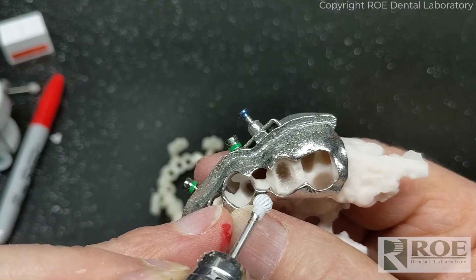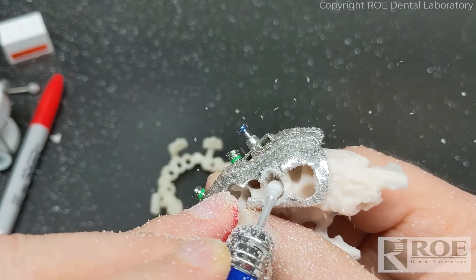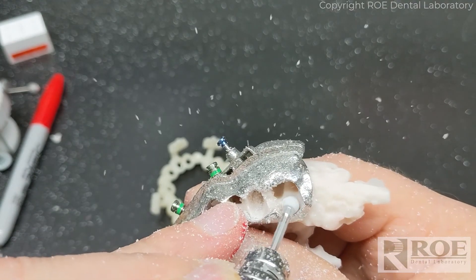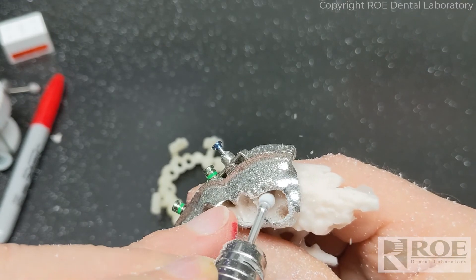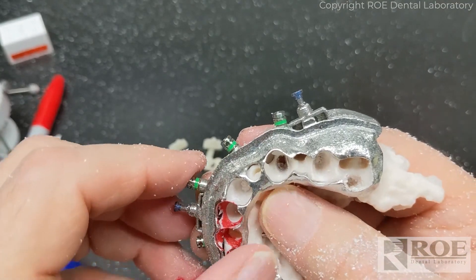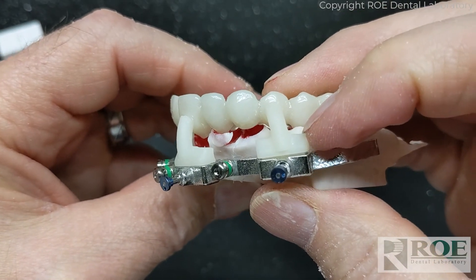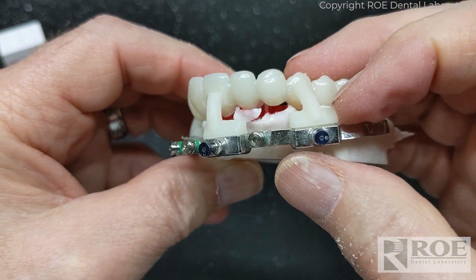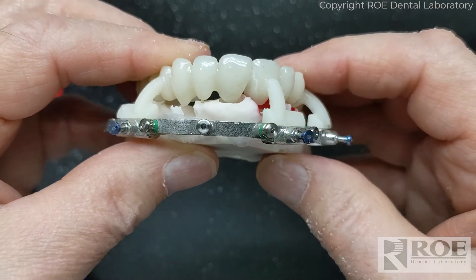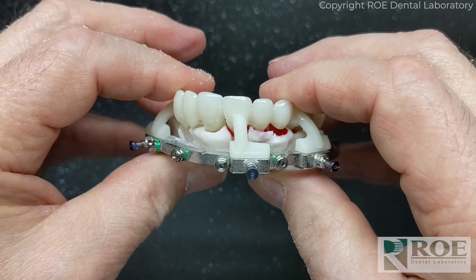The prosthesis now fits. I am however going to use the guide to open up the crest of the bone to the footprint of the prosthetic tooth itself — it won't be a lot of work. I'm trying to leave as much intercrestal bone as possible, and that's the end of what we have to do. The prosthetic fits down, the sprues and the boxes that attach into the locking mechanisms are flush with the fixation base, everything is down, there's no rock from one side to the other, and we're ready to pick up cylinders.